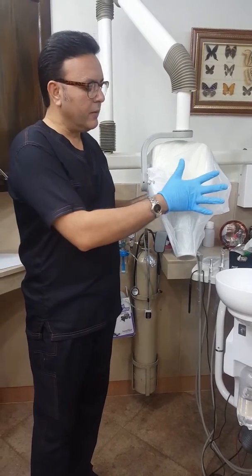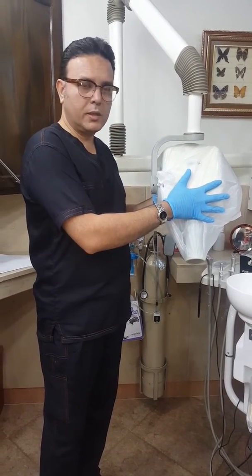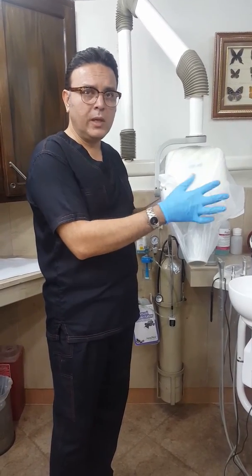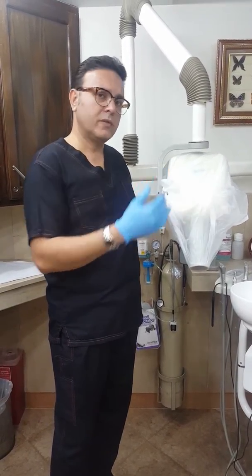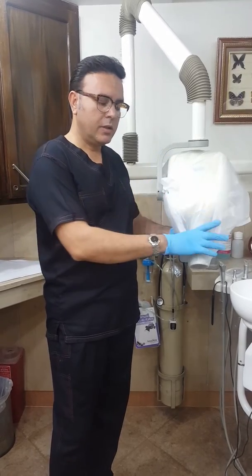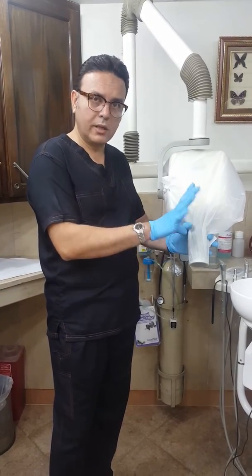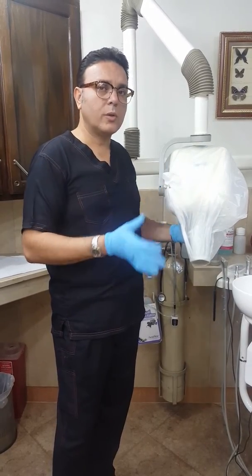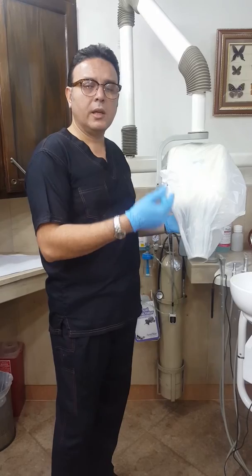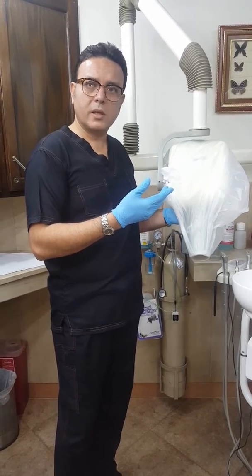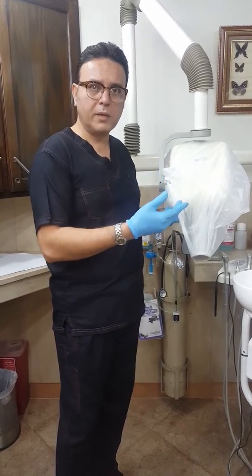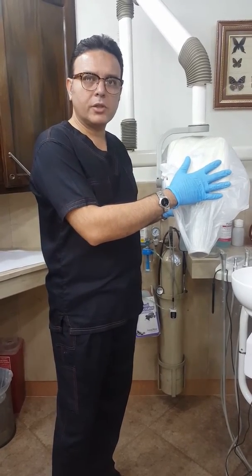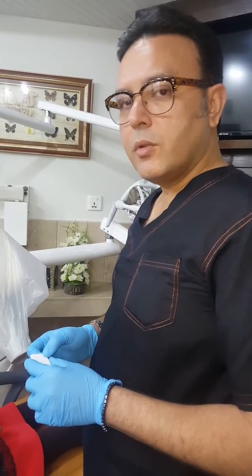Another thing to recommend: whenever you have radiographic equipment like the X-ray head, please cover it with a plastic bag—a simple disposable shopping bag. That way you prevent cross-contamination from one patient to the other. You can use the instrument with your gloved hands, and once you're done with the procedure, you take the bag away, throw it away, and put a new one for the next patient. This is very hygienic, particularly in regions where there is a lot of tuberculosis, like Pakistan, India, or Bangladesh. This would prevent cross-contamination.